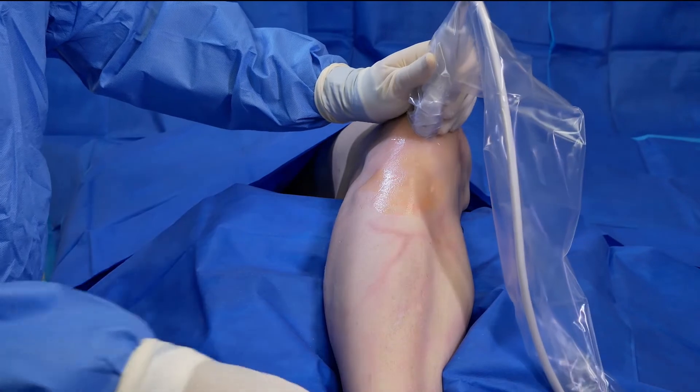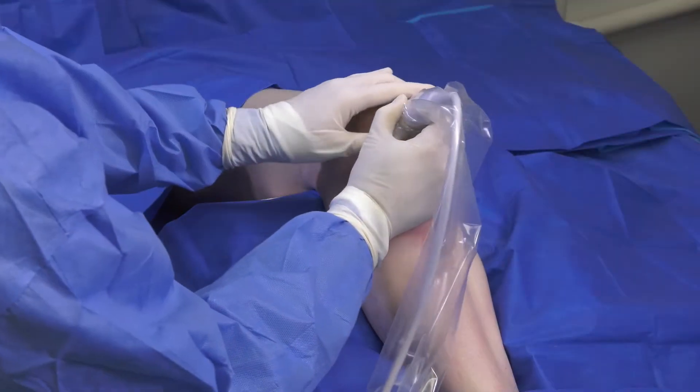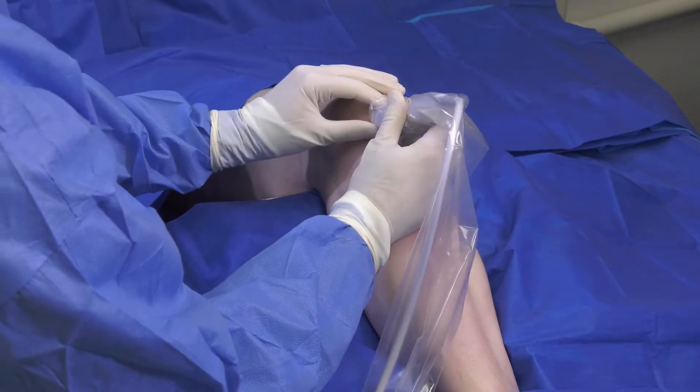The patient is draped and prepped to disinfect the surgical site and create a sterile field. The patient is in a supine position with the knee flexed near 90 degrees.